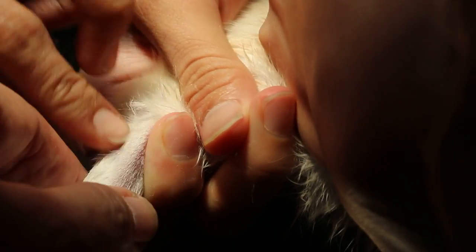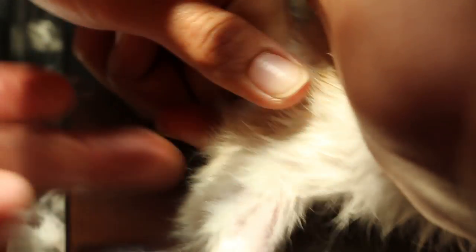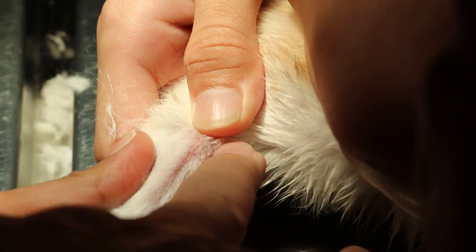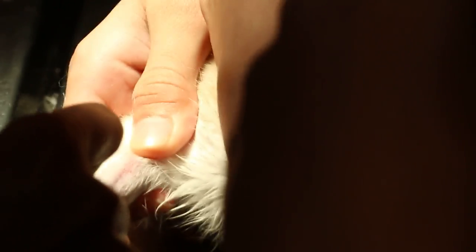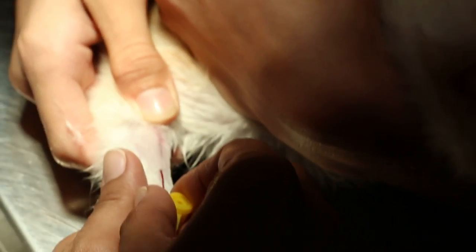You got to shift a bit so that the thing comes out a bit. You just need to twist it a bit — the skin, the whole leg. Then later let go, but keep the thumb. You're almost done. Your third finger — go back a bit. You don't need to twist the whole leg. Go on the elbow. Got it. So this thumb is the most important one. Hold tight to your body. The dog's head — one person talks to the dog. If I say let go, just let go of the thumb, don't let go of the whole leg. She put in the catheter — very strong, stay strong.